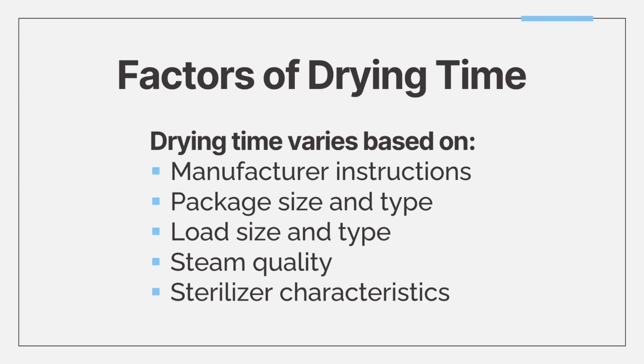And of course, the sterilizer's characteristics itself is very important. So the design, drying features like vacuum or filtered air drying, which we'll get into more next week, and maintenance condition all affect drying performance. Older machines or poorly maintained ones may not dry as efficiently.